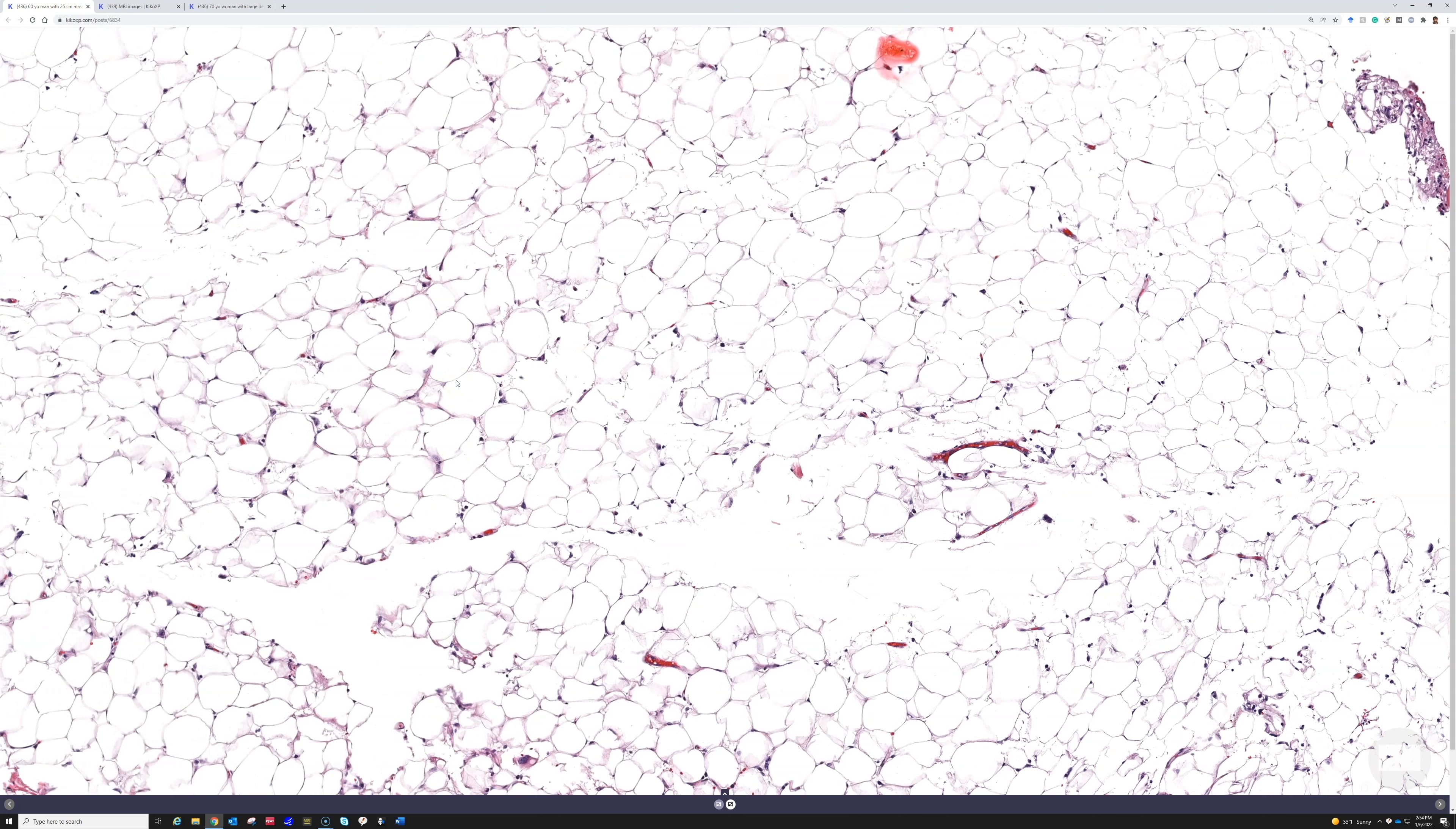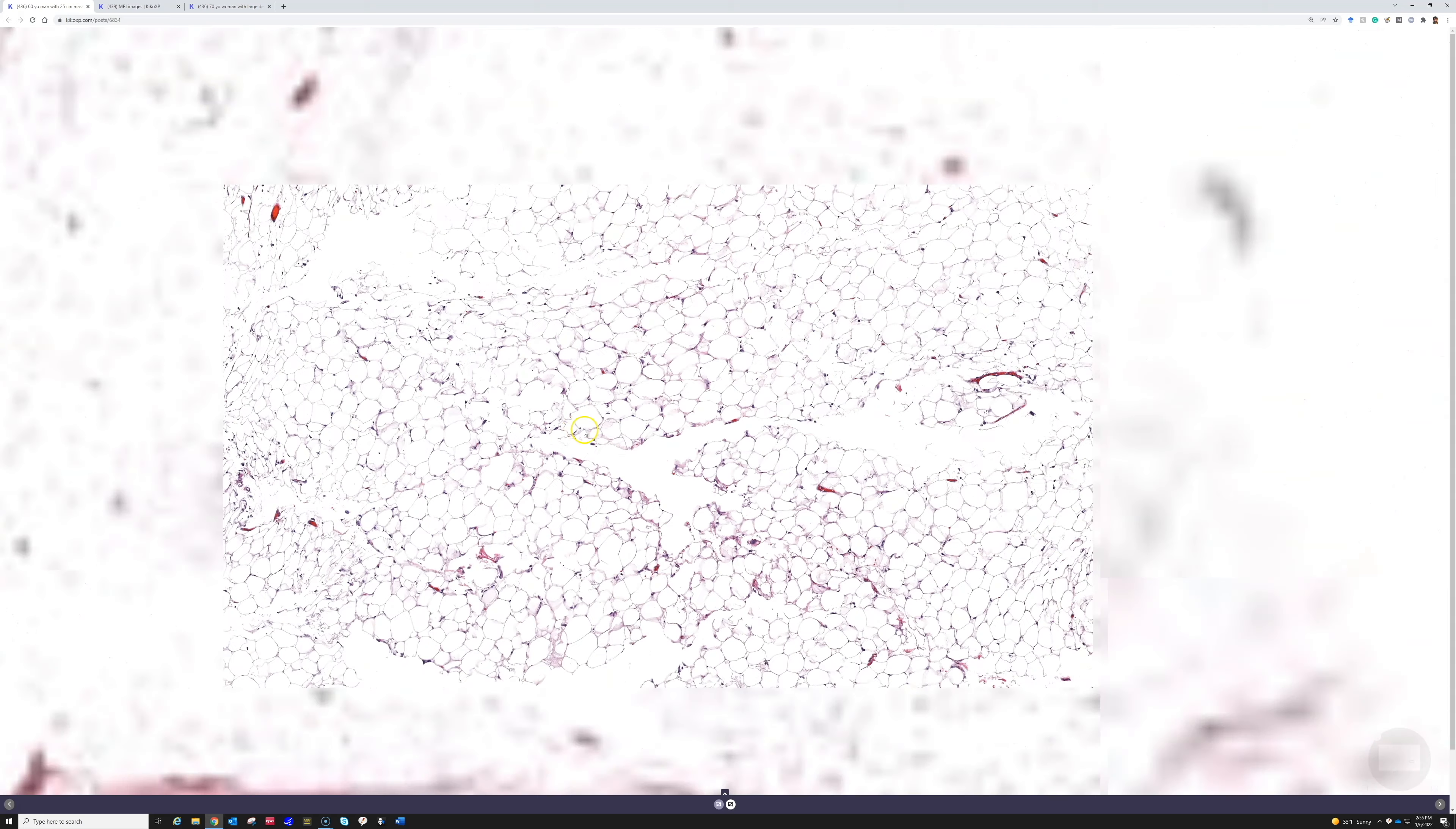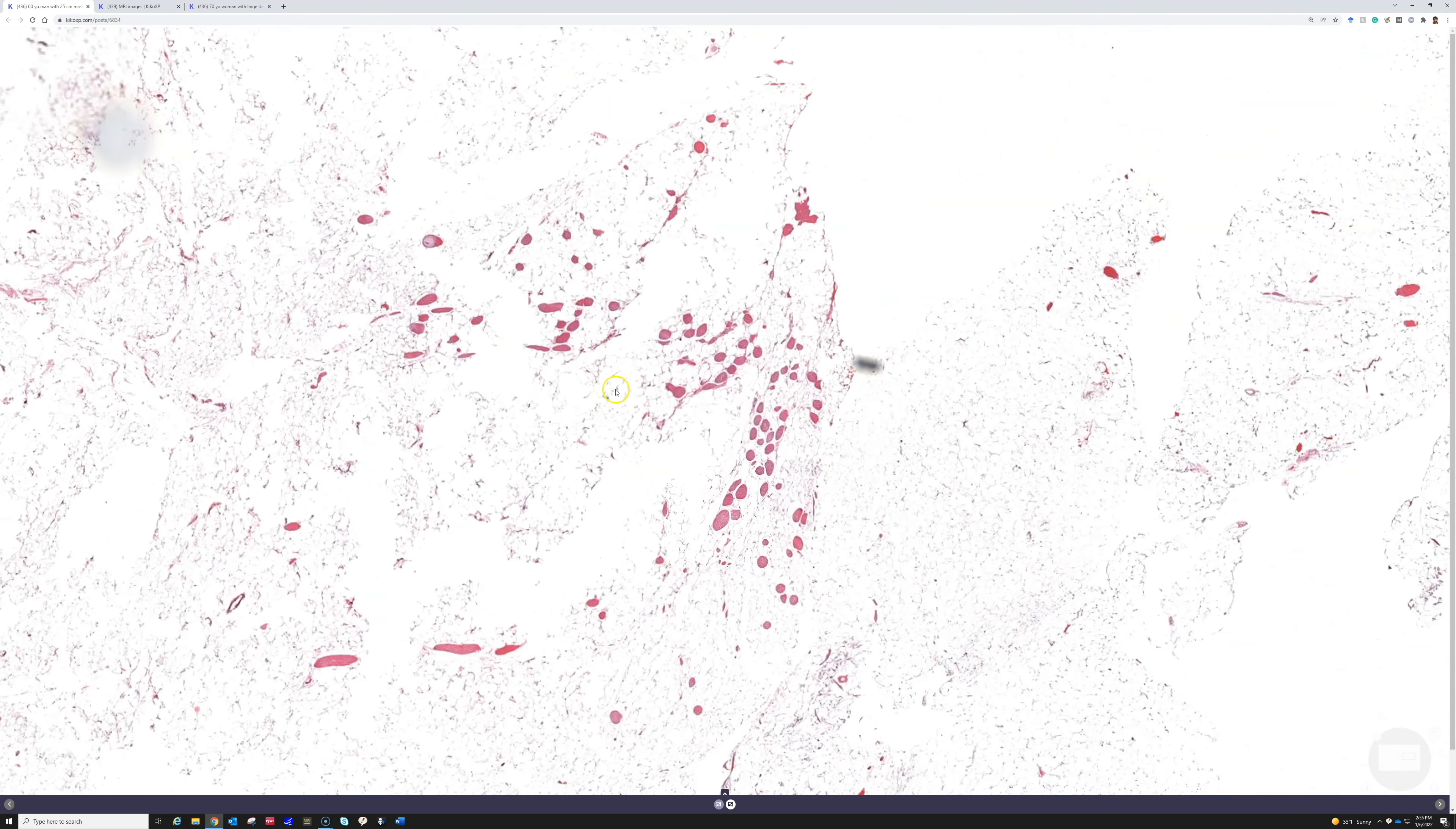Um, so that can sometimes be challenging. So in cases when I find obvious atypia then I can make the diagnosis of atypical lipomatous tumor or well-diff liposarcoma depending on the site. In cases where I have uncertainty then I do MDM2 FISH to confirm the diagnosis, and it's a very sensitive and specific marker to distinguish a lipoma from ALT slash well-diff liposarcoma.